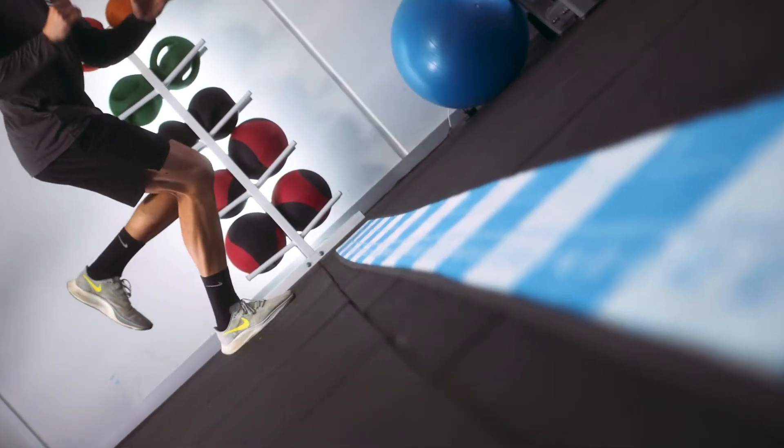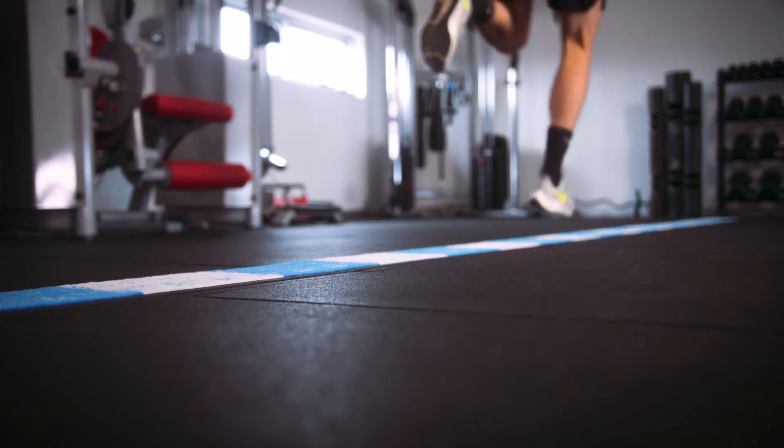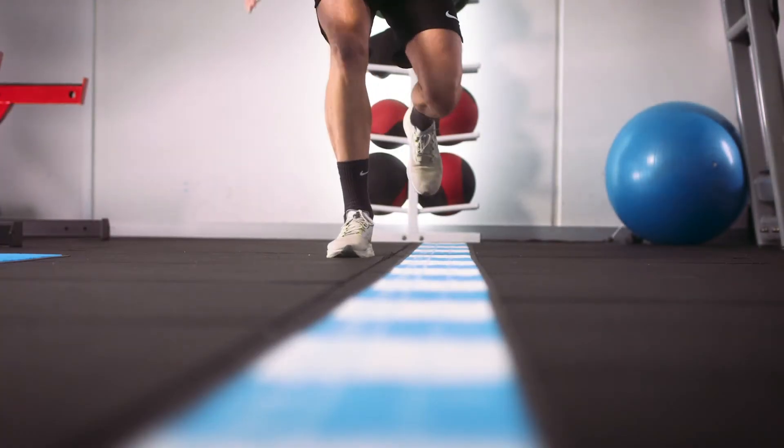If you work with athletic individuals, then you need the HOTMAT. The HOTMAT is designed specifically with the Limb Symmetry Index in mind, a battery of tests that have been shown in the evidence to have great reliability when assessing lower limb performance and function.